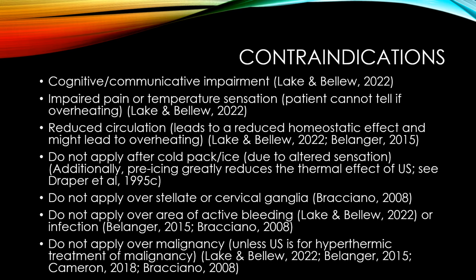If the client has reduced circulation in the area where you want to apply the therapeutic ultrasound, that would also be a contraindication. The reduced circulation will lead to a reduced homeostatic effect. The body won't be able to cool as efficiently and might lead to overheating as a result.